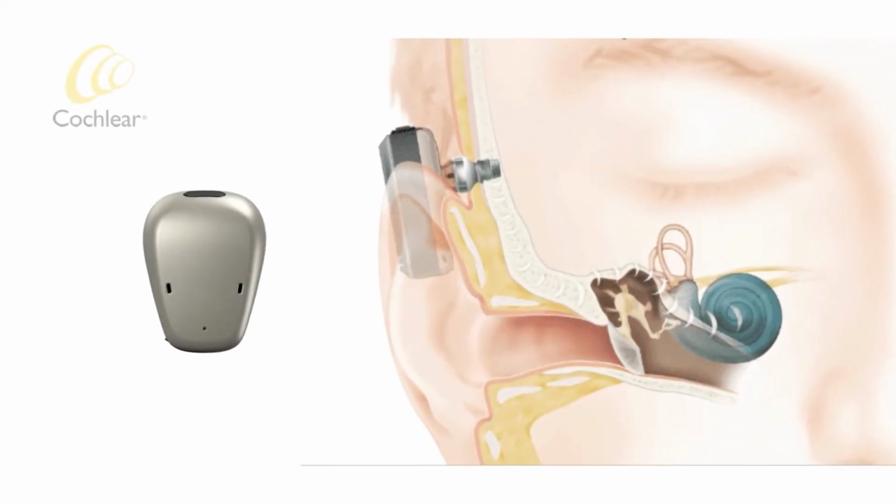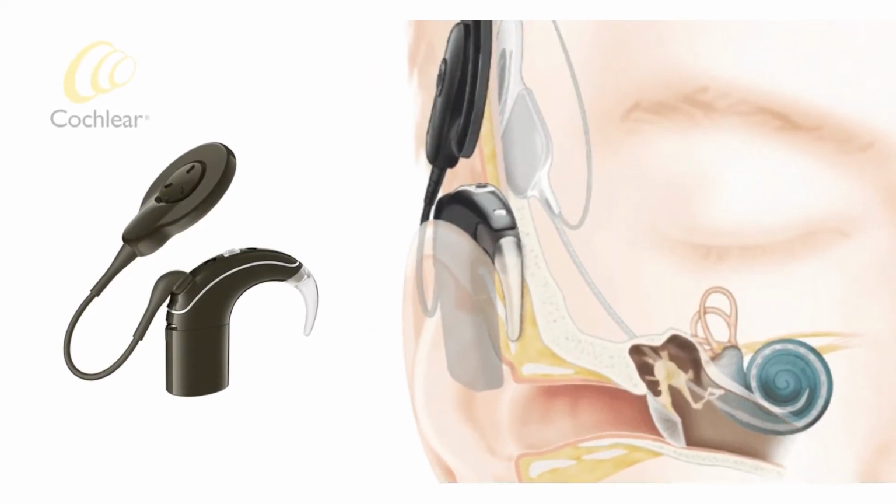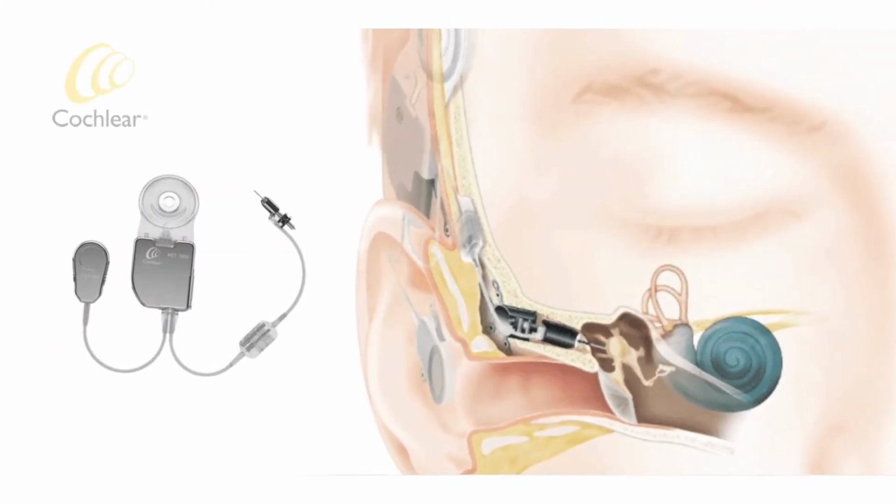Yeah, that's excellent. Well, certainly we talk about bone-anchored devices and bone-anchored solutions, and we also talk about cochlear implants. And then the third category that we talk about is AMEI, or active middle ear implants. Interestingly enough, that's still an active category in the implantable space. Cochlear sort of dabbled in that for a while. We never had a product that was approved in the United States or reviewed by the FDA, but we're a global organization. And of course, the products that are out in the global space were in fact introduced and used clinically. At this point in time, we included that data because it was in the IROS database. We included that in terms of its selection, but very much aren't doing much in that area now.